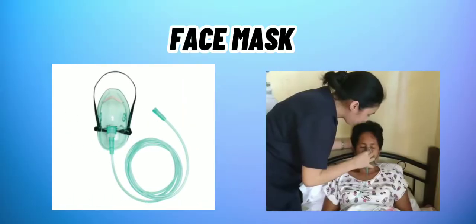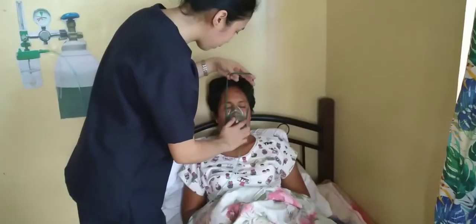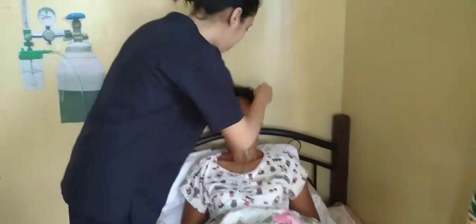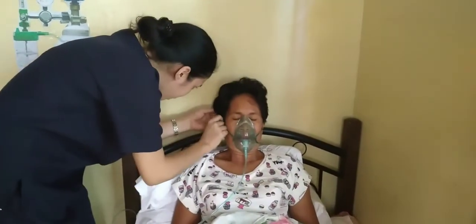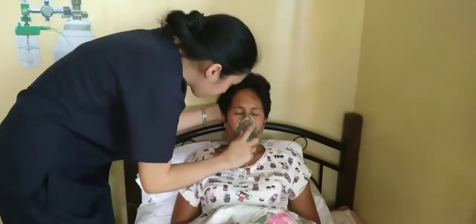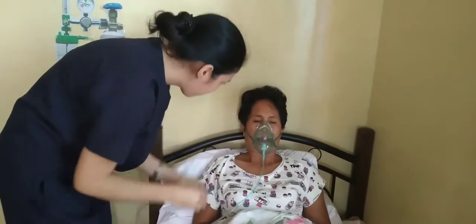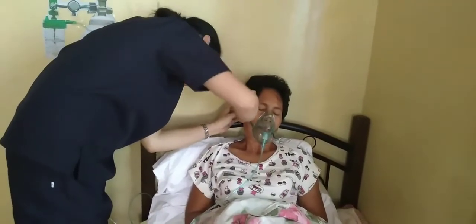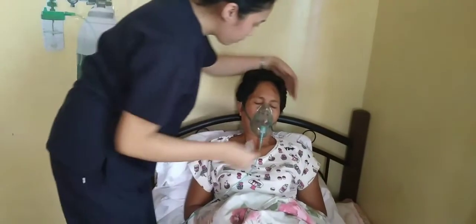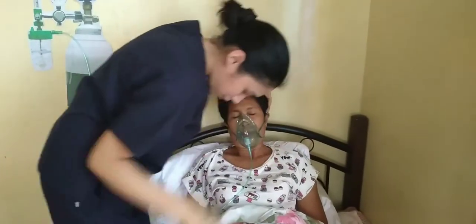Another oxygen delivery device is the face mask. Place the mask toward the client's face and apply it from the nose downward, making sure it fits the contour of the client's face. Secure the elastic band around the client's head snugly and comfortably, then pad the band behind the ears and over bony prominences to prevent skin irritation.